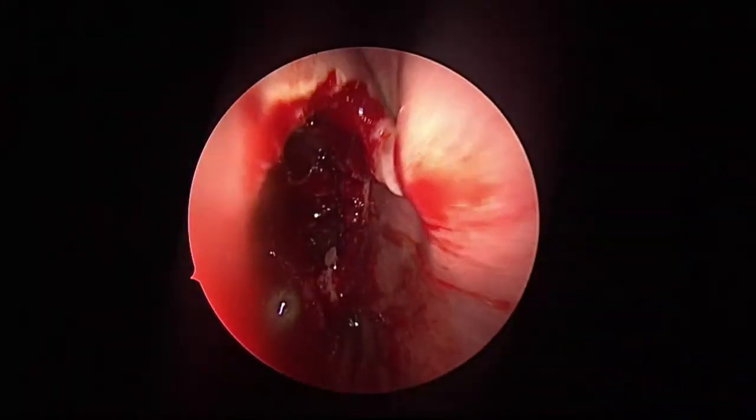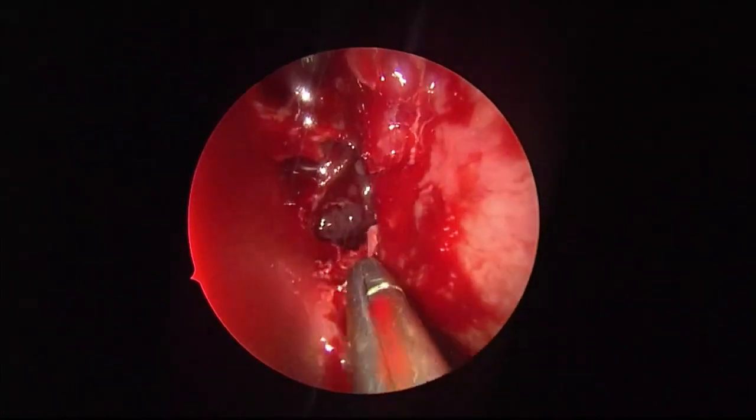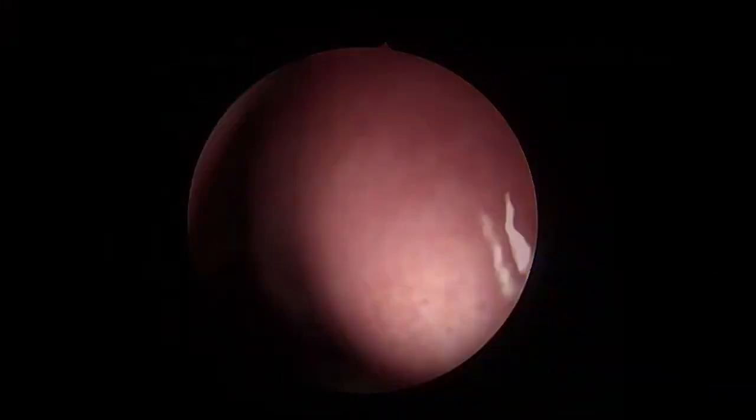And see this now, it is very stable. It is not going to fall back and close the ethmoidal cavity. This is partial resection. Now I'll use the 70-degree in all sinuses, one by one. Last two maneuvers, and then this case is over. Next is ready. Next is JNA.